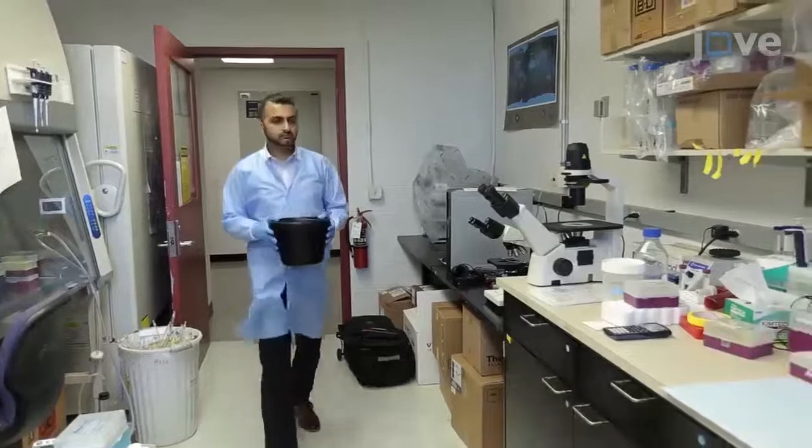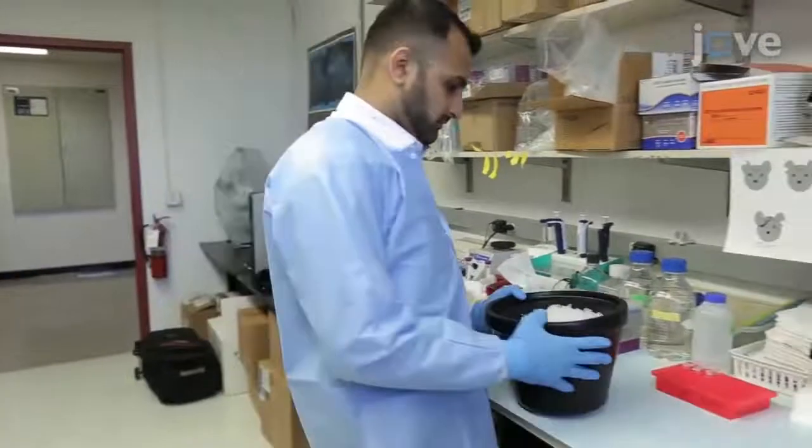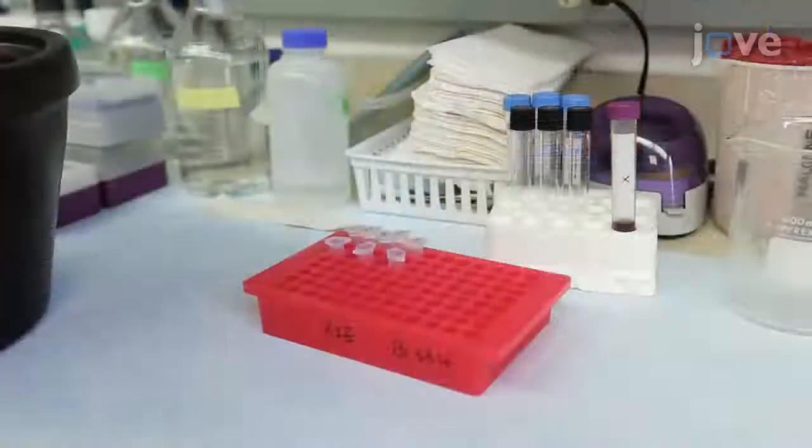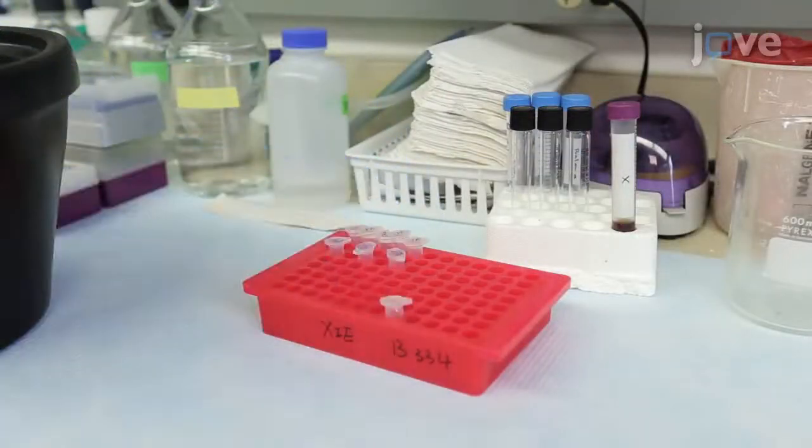When all the mice have been injected, return the animals to their cages for housing in a specific pathogen-free facility. At the appropriate experimental time points, collect 150 to 200 microliters of blood from each immunized animal by retroorbital bleeding and allow the samples to coagulate at room temperature for 1 to 2 hours.